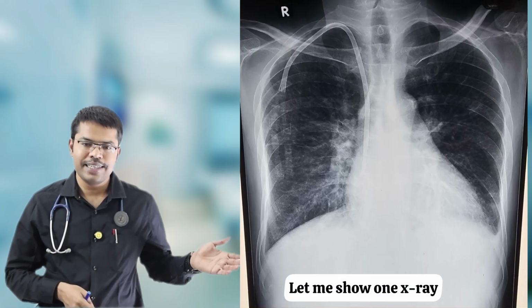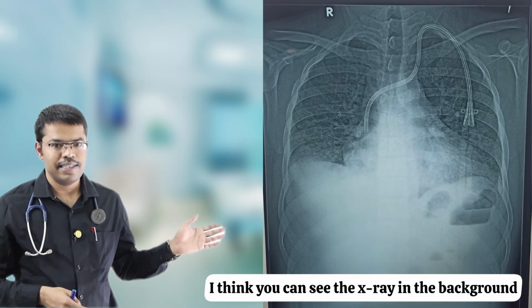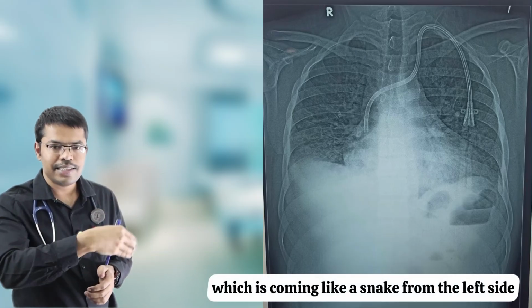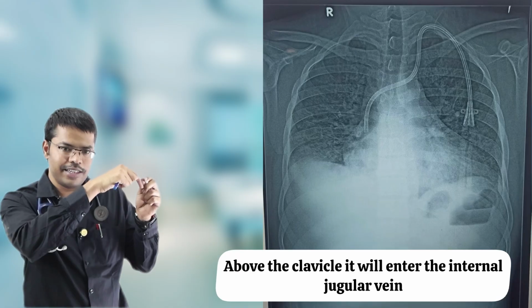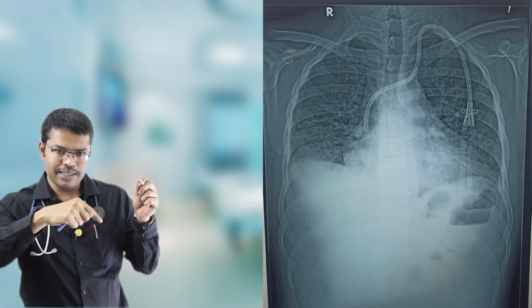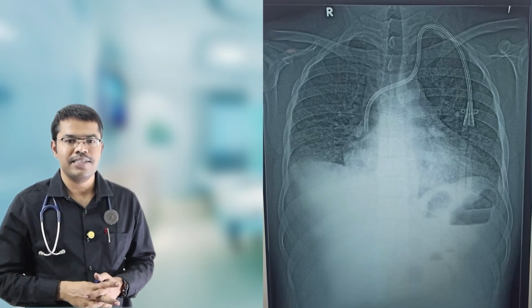Let me show one X-ray which is showing the permacath on the left side. I think you can see the X-ray in the background. Now you can see the permacath which is coming like a snake from the left side. There is a U-shaped entry. Above the clavicle it will enter the internal jugular vein. Then it connects into the brachiocephalic trunk, goes to the SVC and goes to the right side of the heart. So this is the X-ray on the left side.